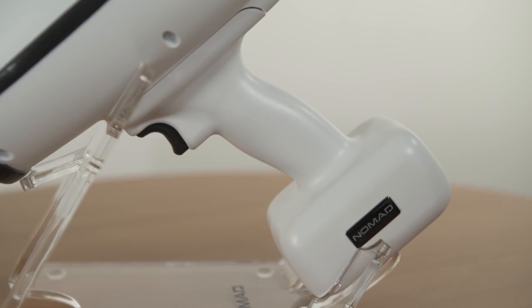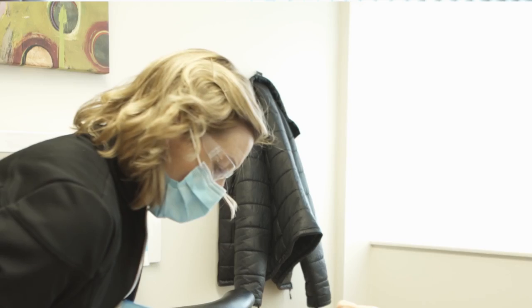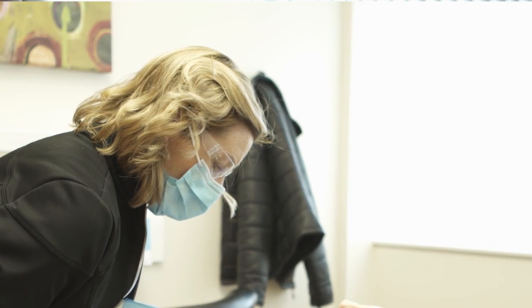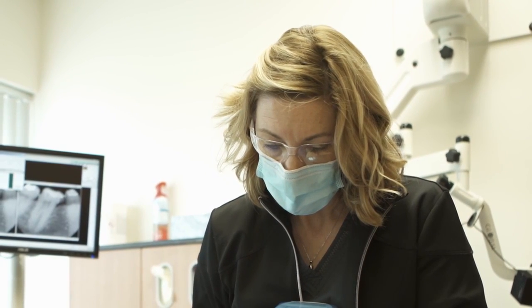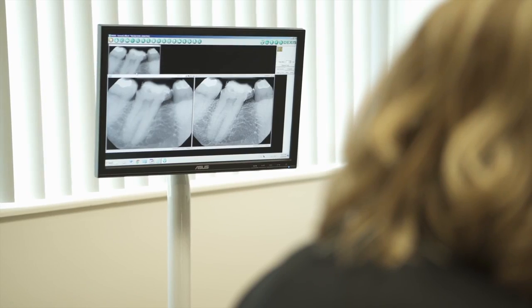It just seems like it's a lot faster for the patient. There's so much stigma around x-rays. Now, if they see me right there in the room, I think it's going to make them even more comfortable to know, oh, she didn't even have to go out. That, and I can see if they're holding the x-ray properly. Sometimes it'll move, and then I'd have to take another x-ray, and so if I'm right there, I can see if it moves and readjust it.